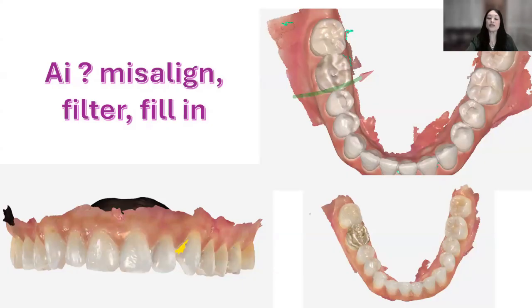Here's a tip and trick. How do we avoid getting those arrows? We talked about our initial scan of the occlusal table. Be sure that you have 100% of the occlusal table, and that 2 millimeter buccal lingual from canine to canine will be your certainty that you will not have those arrows. Because when you go to build the buccal lingual wall, it would overlay seamlessly.